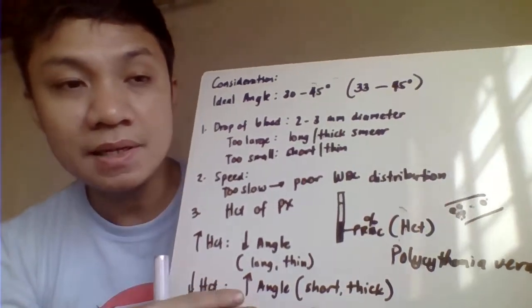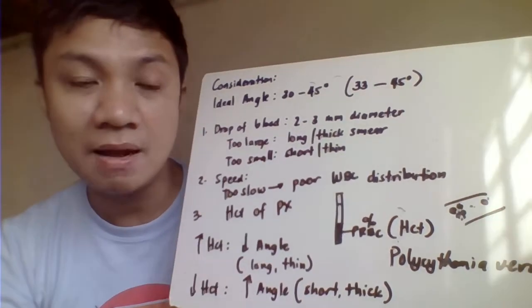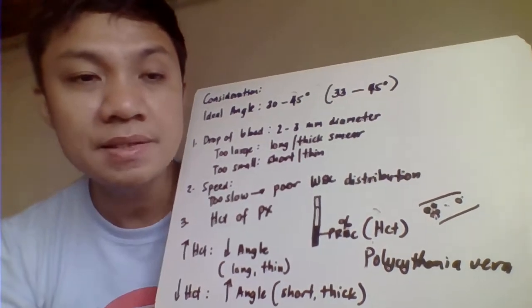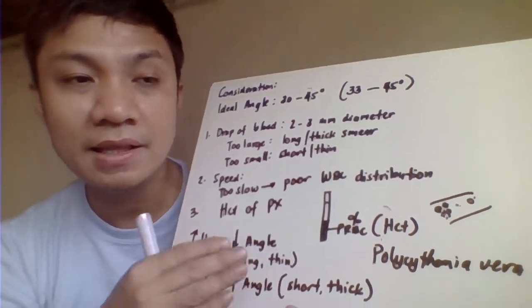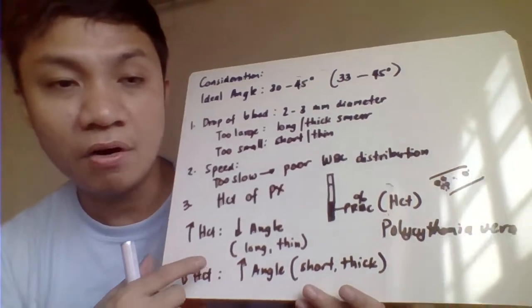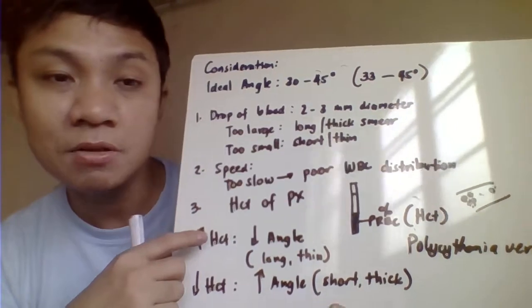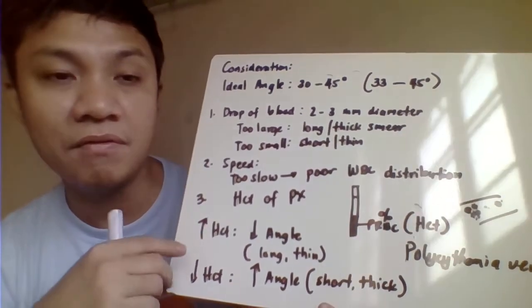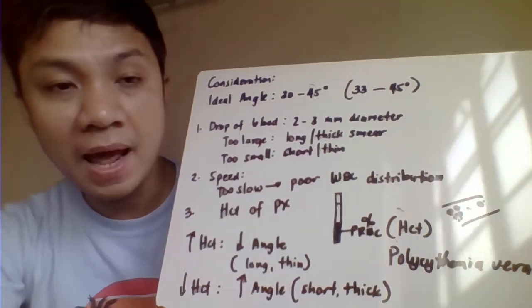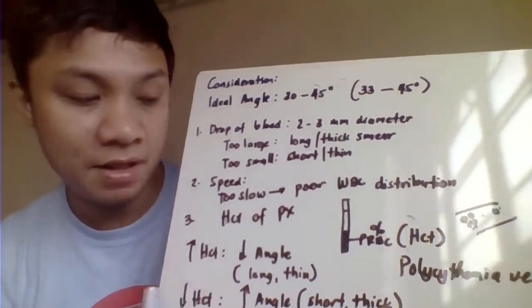Kung nag-overlap ang cells natin, like tinakpan siya ng madaming RBC, hindi mo na makikita ang platelets. The same through with your WBC, kasi of course you could not identify what kind of WBC, since your cells are overlapping because you have a very thick na film. That's why you need to make necessary adjustment with that if you have an increased hematocrit concentration, just need to lower the angle in order for you to produce here a longer and thin na film.